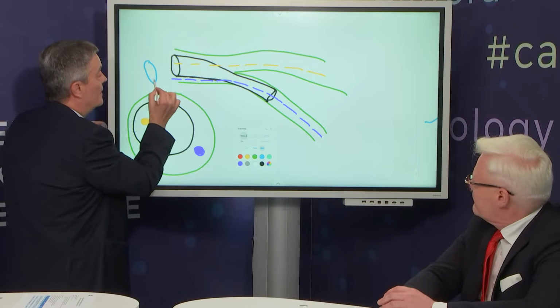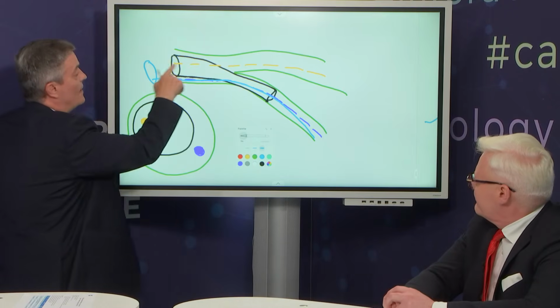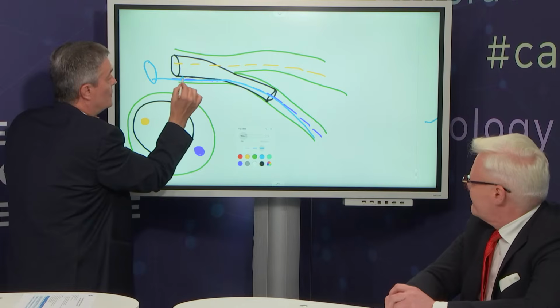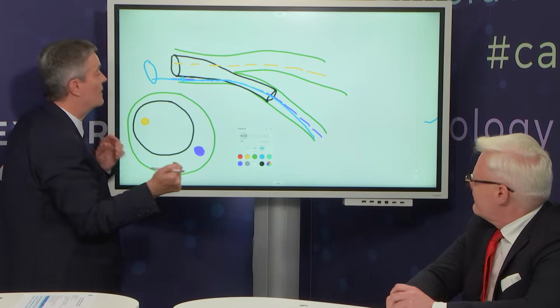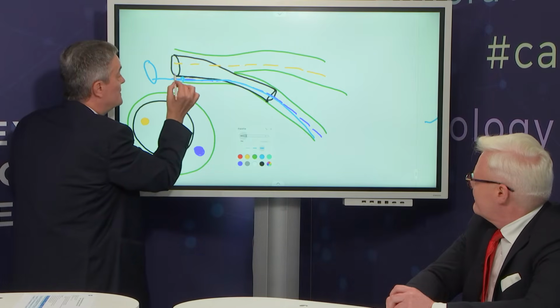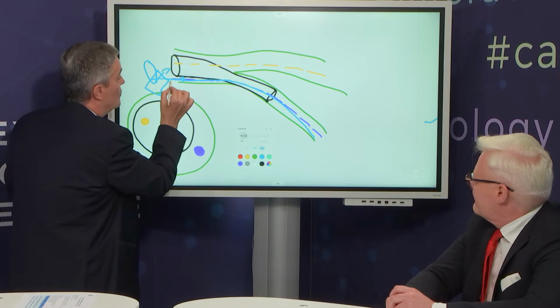Option number one is that your wire from the guiding catheter goes completely abluminal and then inside the stent. Then you have one wire through the stent in the main vessel, one wire abluminal, and when you do kissing balloon inflation, you actually compress the stent. And this is not easy to understand from angiography. Option number two is that your wire does not necessarily go abluminal throughout the length. Just after a couple of struts, especially with this kind of position of the guiding catheter, it can go a couple of struts outside and then inside the stent.